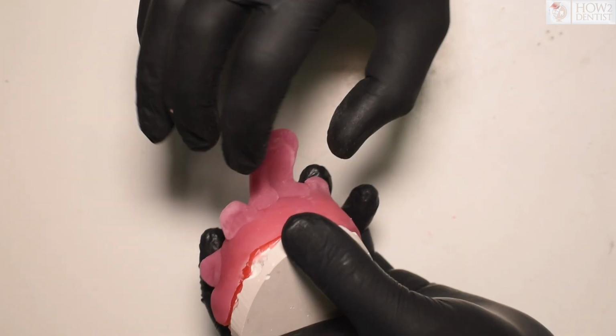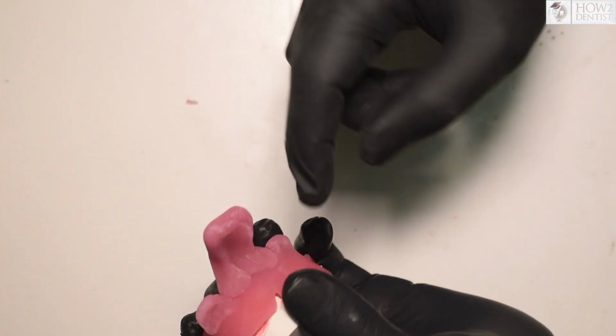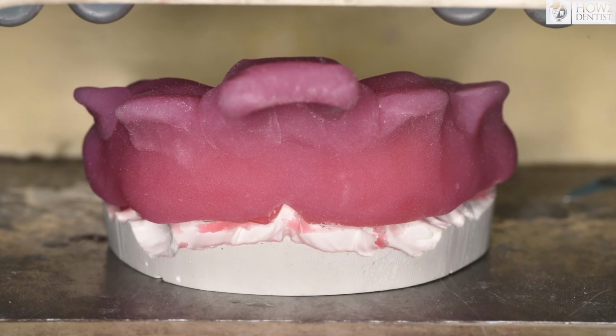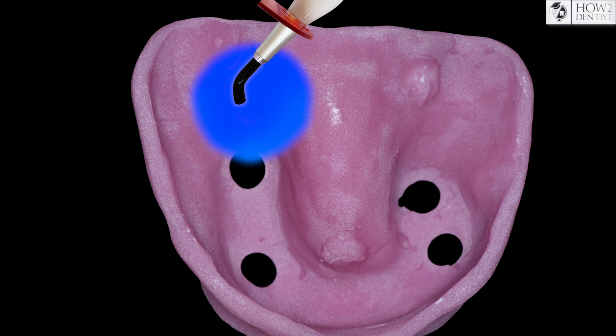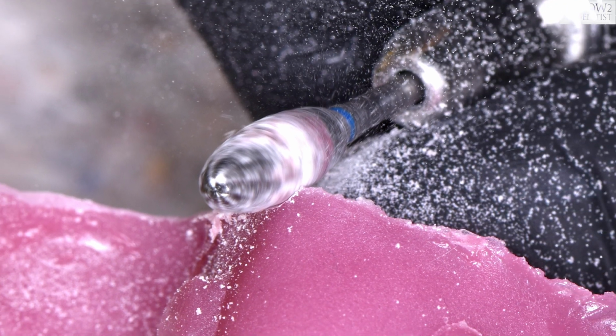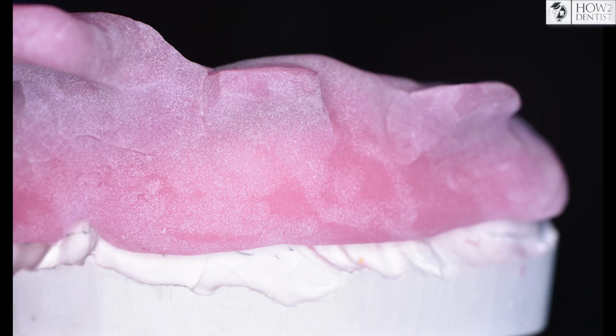After everything is covered by the material, the handle is made, and if desired the wings for removing, and the tray is polymerized in the light curing oven. Then we remove the tray, polymerize it from the inside, and it remains to smooth the stoppers so that they do not hurt the mucosa, and decide what mass will be used.